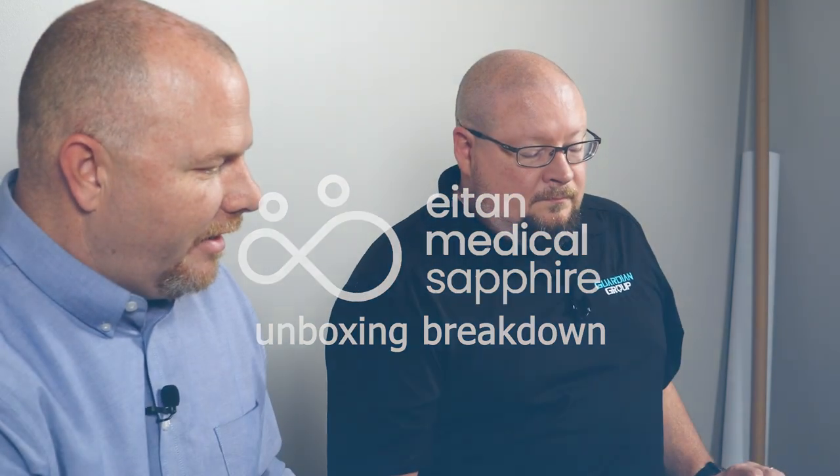Let's get into the unboxing. I'm a paramedic, Mark's a paramedic — been in the field for several years. There was a pump prior to the Sapphire in the EMS world, and one of the reasons it was pulled from the market was that it was found to be grossly inaccurate. One of the high points of the Sapphire pump is that the accuracy is plus or minus 2.5%, with the industry standard being plus or minus 5%. That was a huge thing when I heard how accurate the pump was.